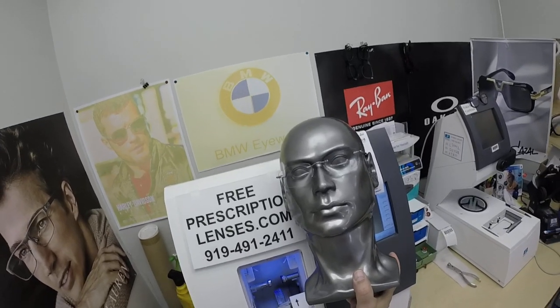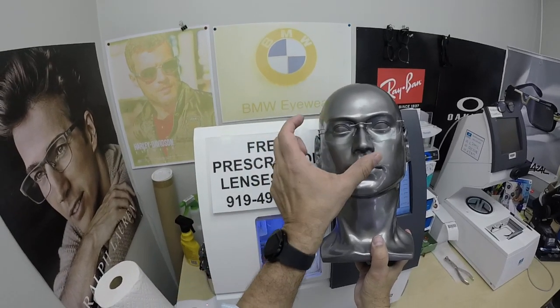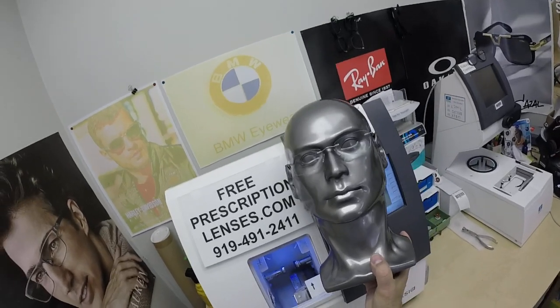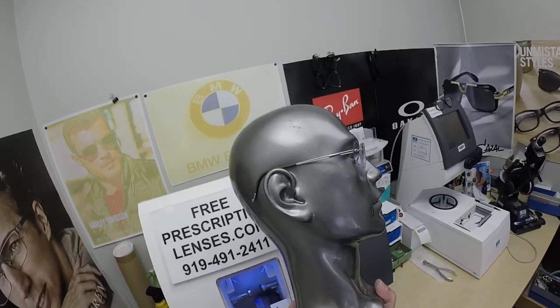These frames will spoil you — there's nothing lighter. A lot of times people will just get them as sunglasses in a slightly larger size, because I recommend going larger for sunglasses for overall coverage. I even put a little more curvature onto the lens so it wraps around a bit more.